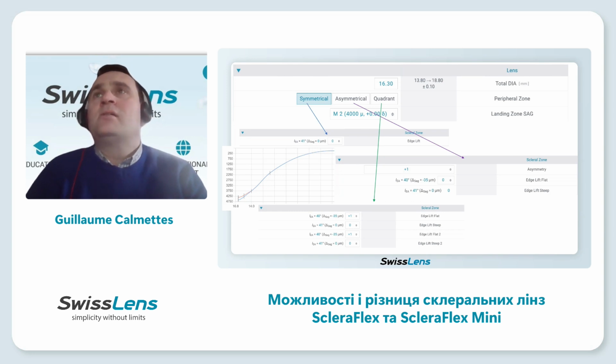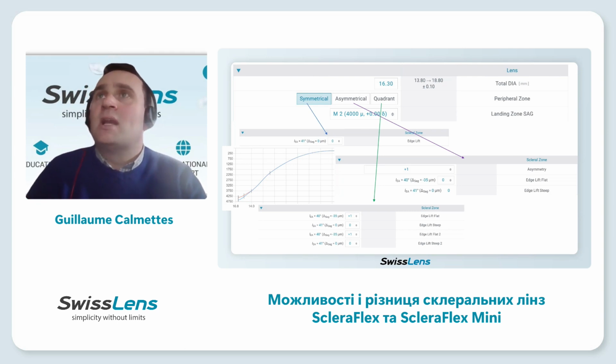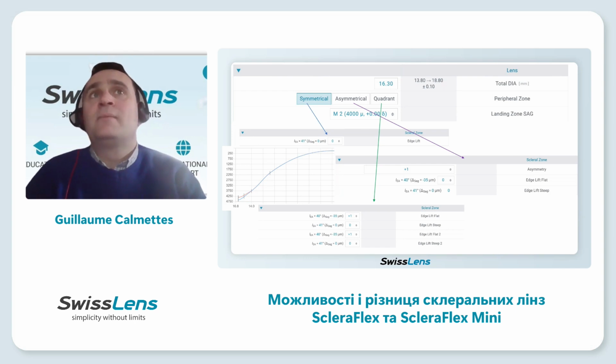For an asymmetrical lens, that means you're changing only one part of the lens, or only the horizontal part of the lens. And so it's something you can combine. That means you can change edge lift and you can also change lens asymmetry. We use asymmetry a lot when your lens is a little bit decentered down, because we know that on scleral, the horizontal meridian is a little bit flatter than the vertical one. So it's something we use for that.